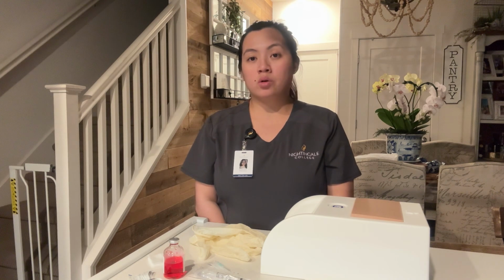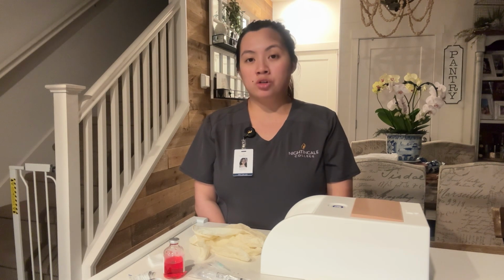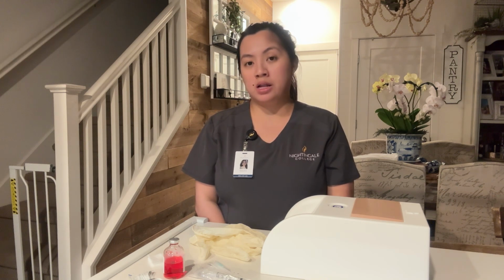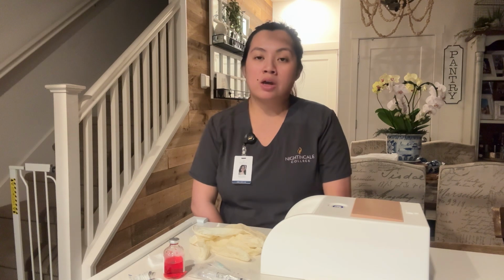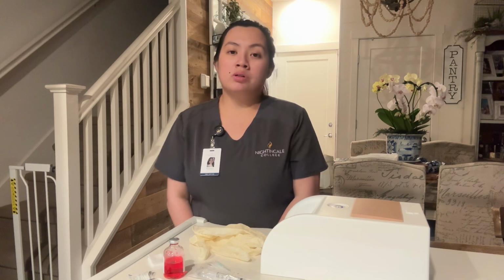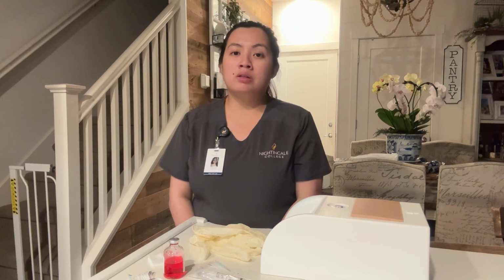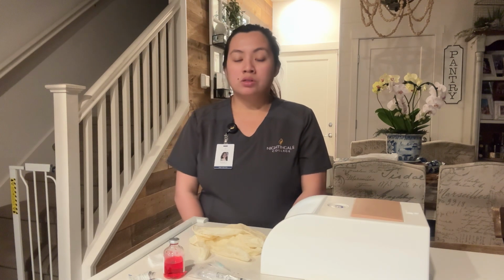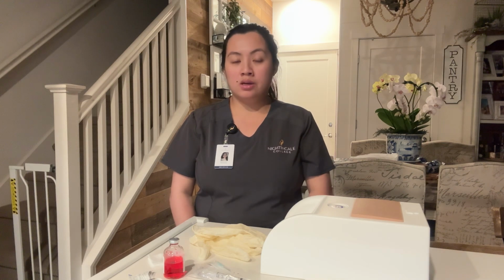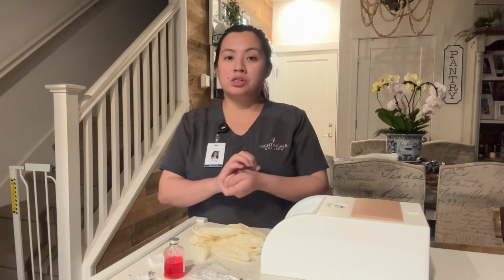So the doctor has ordered 1,000 units of heparin, but the available concentration is 10,000 units per 10 milliliters. So after calculating the correct dose, we are going to administer 1 milliliter or 1 ml. So I will now enter the patient's room and close the door for privacy, and then perform hand hygiene.